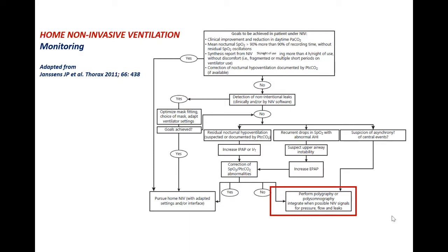And in recent years we had a lot of progress by different companies in ventilator software, very interesting because on this software we can know about leaks, apnea-hypopnea index, median tidal volume, and with all those tools, a lot of settings can be adapted.